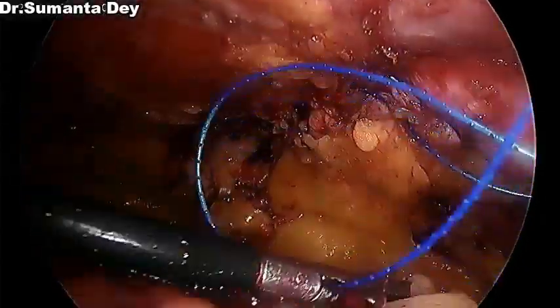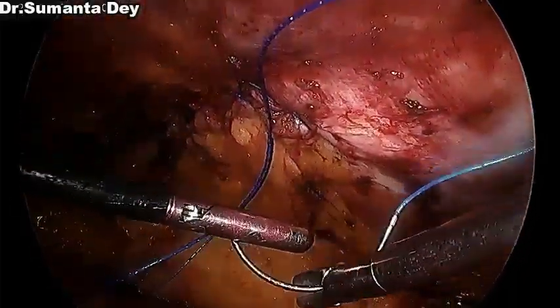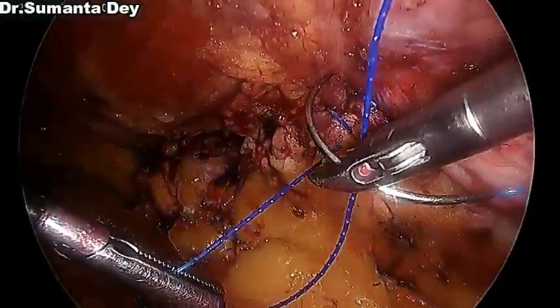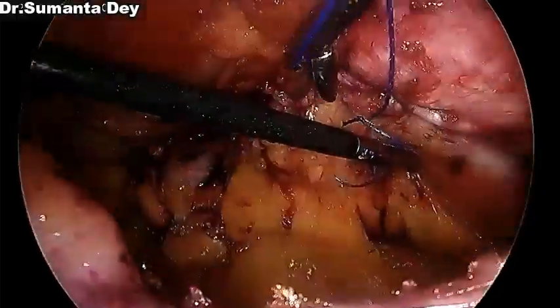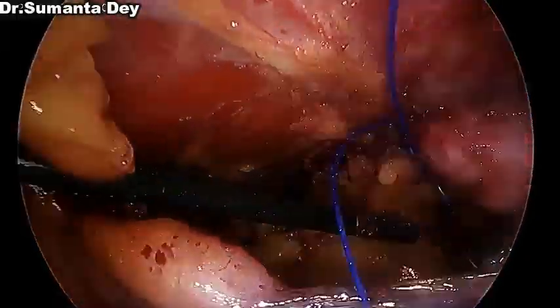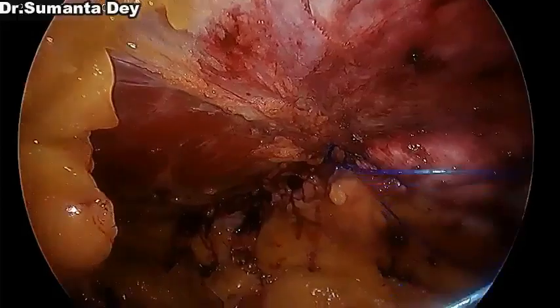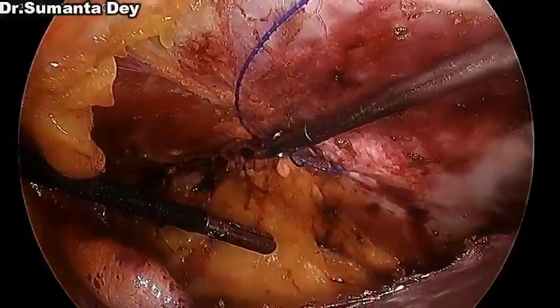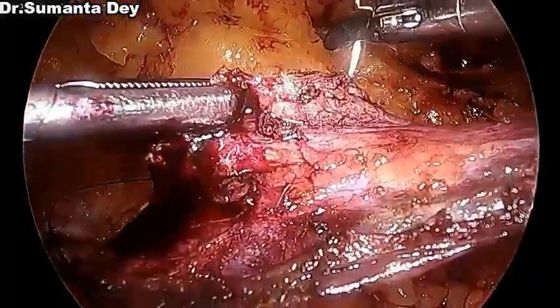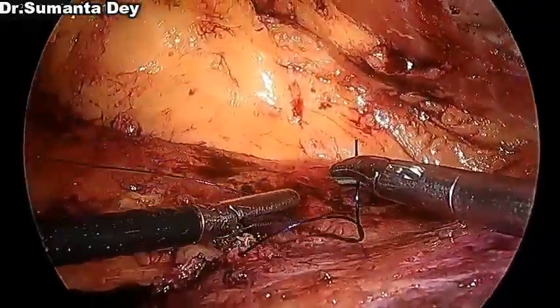So that will give a good closure. While closing any hernial defect, you should decrease the pressure of the pneumoperitoneum. In this step, hernial defect closure, I have decreased the pneumoperitoneum to 8 mm of mercury or 10 mm of mercury, and it will help in defect closure nicely. You should always decrease your pneumoperitoneum till you close the defect, and then before the next step, you can increase the pneumoperitoneum pressure again.